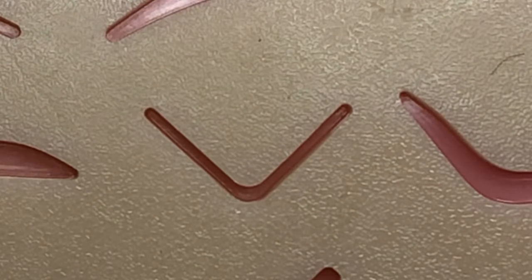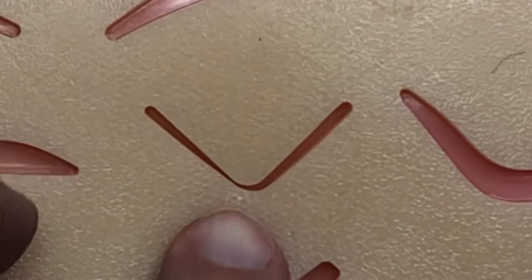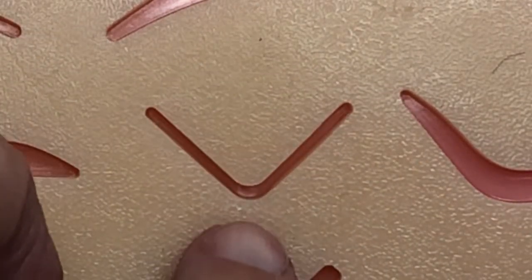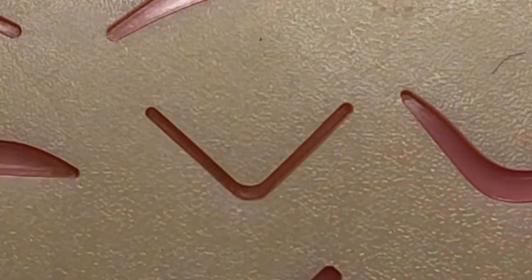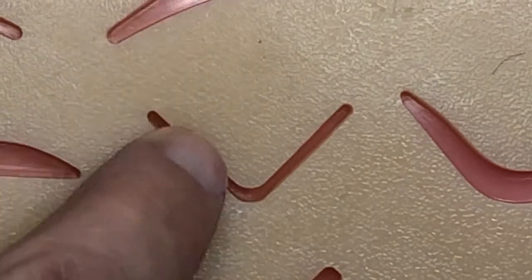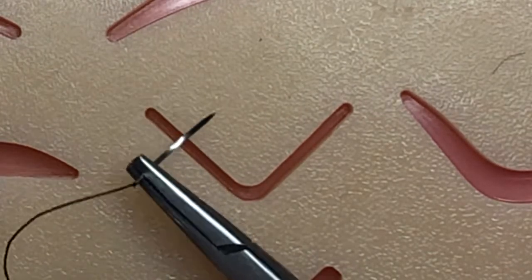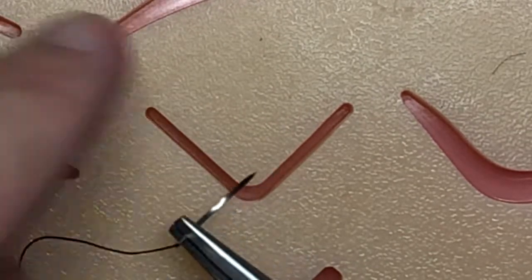Whenever I approach one of these, what I try to do is get the apex of this wound secured and taken care of first. Because if you don't, what's going to happen is if you start on one of the ends, you're going to start suturing, putting some knots in here, putting some sutures in.